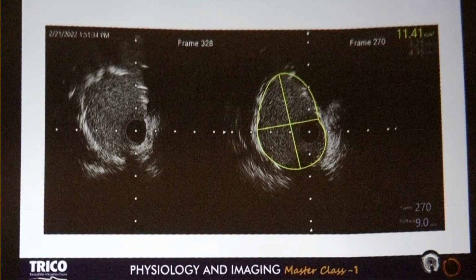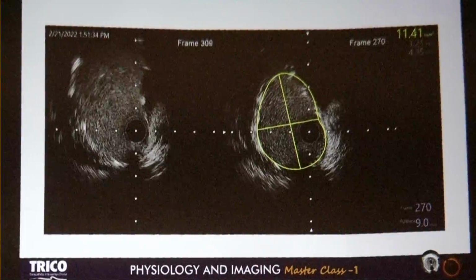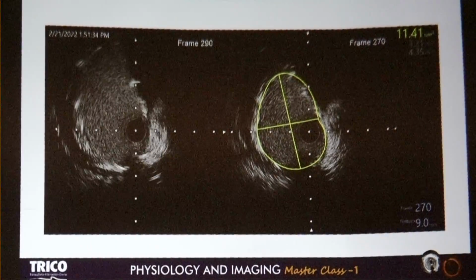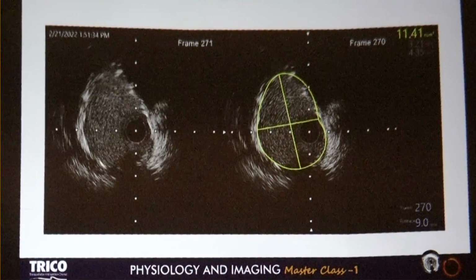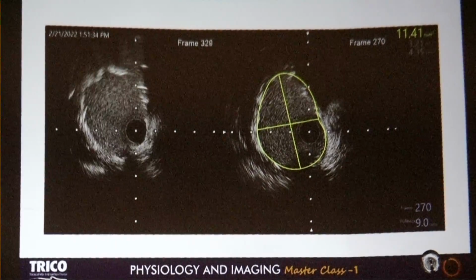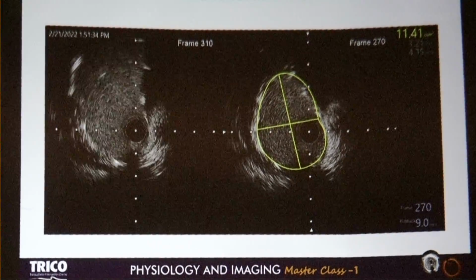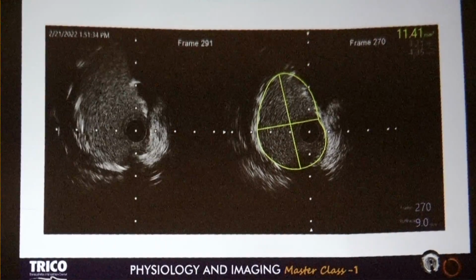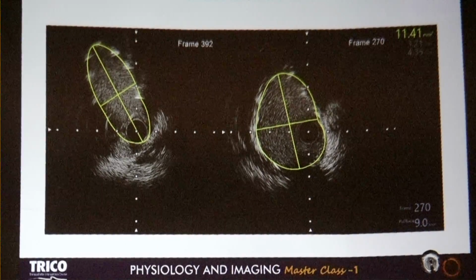So every time you evaluate, particularly in the left main, all young guys who have started doing it, make sure that after stenting, pull the guide catheter a little bit outside the left main, hanging in the aorta, and do your IVUS run to avoid this type of complication. It was a very simple case, but I think it had some good message, so I have kept it. Just you can see the difference.